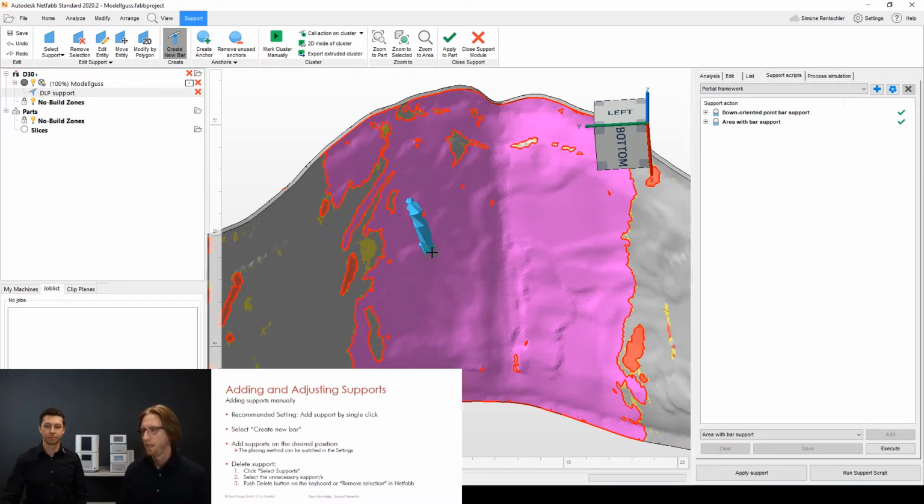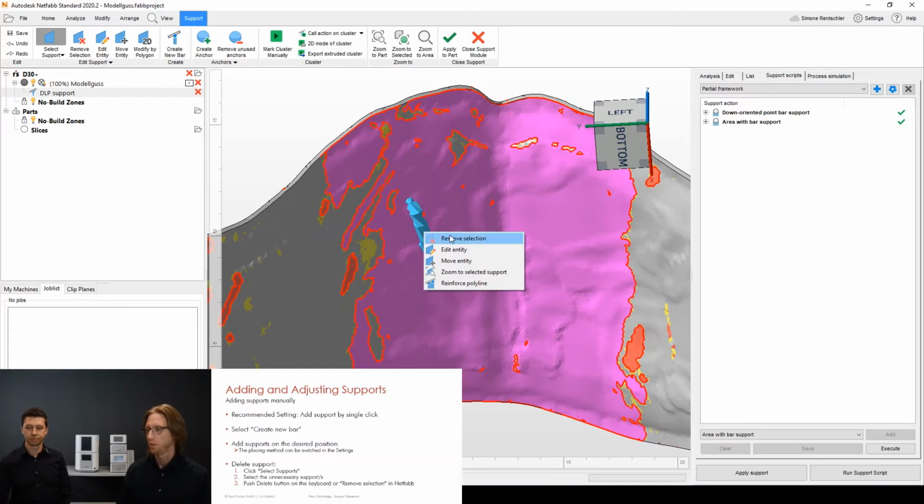About the deleting of the support, you would just go to select support. This is the button on the top left corner. You just highlight the support you have here. This is already selected because this is just one. So the lighter blue shade indicates that this is the selected support. And then you just perform a right mouse click to get into the context menu. You go to remove selection, and this is it.